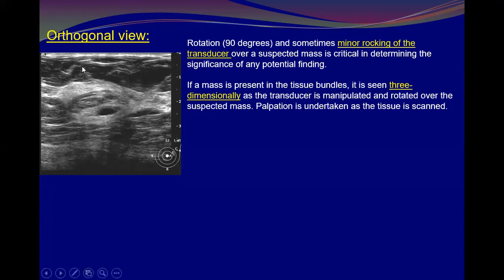Yes, definitely the parenchyma here is going parallel, then here it is elevated. It is humping, so it can be a smooth palpable abnormality. A large area of palpable abnormality can be here because it is a little bit elevated from the rest of the parenchyma. Here it is not as parallel as the rest of the parenchyma.